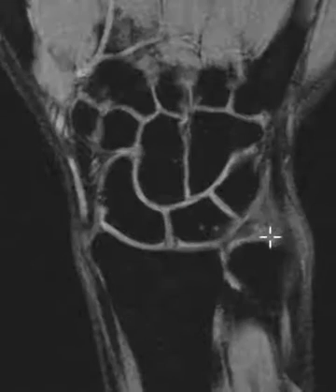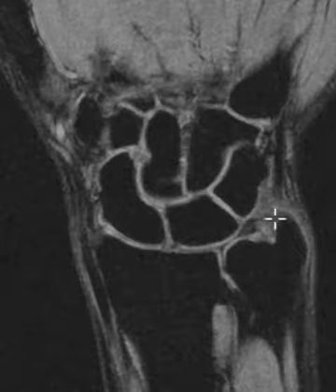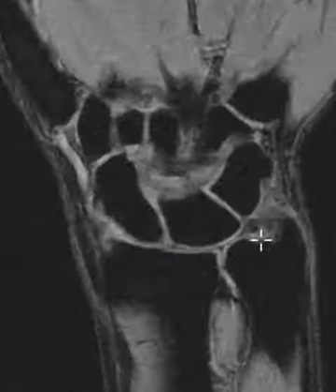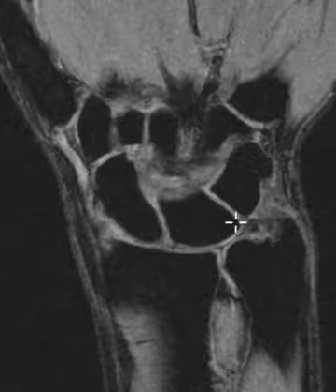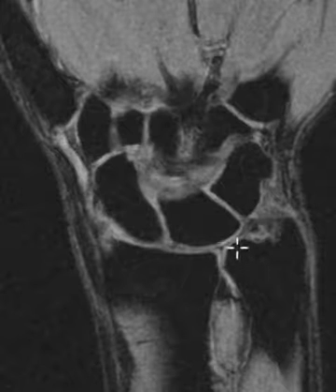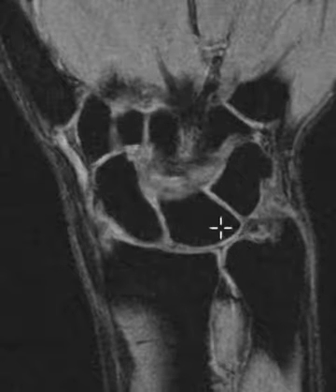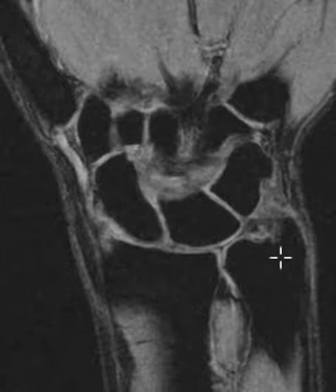The other components of the TFCC — this is the dorsal band here, the foveal attachment, the styloid attachment — everything looks good. Just marked thinning of that central disc, and there are no bony changes. Over time this can cause what we call ulnar abutment syndrome, or ulnar impaction, where the ulna hits the lunate and you get cystic changes and marrow edema in the base of the lunate here, but this patient does not have that yet.